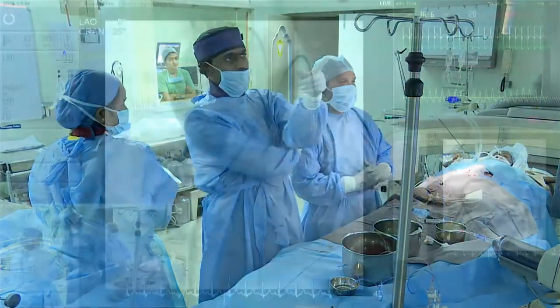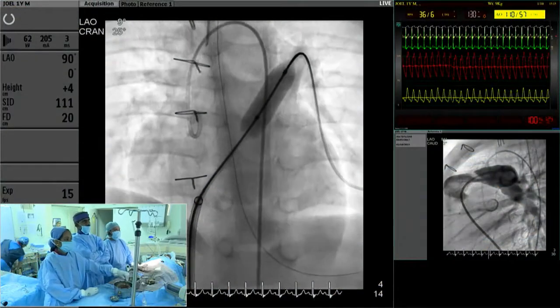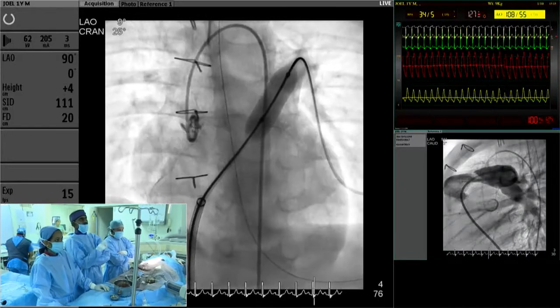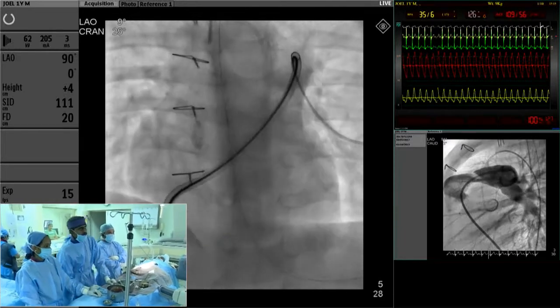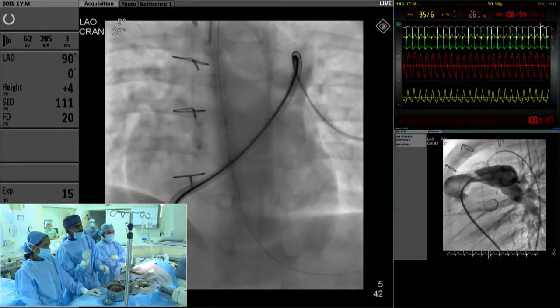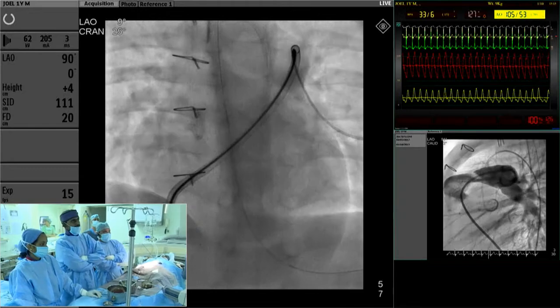So this is the place where we left. This is the balloon occlusion, and with the balloon interrogation we can identify that the aberrant left anterior descending is filling well. Next picture. So we decided to choose a 12 millimeter Opta balloon, Opta Cordis, and we mounted the Formula stent on the 12x2. Next picture.